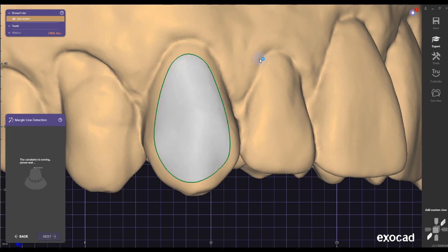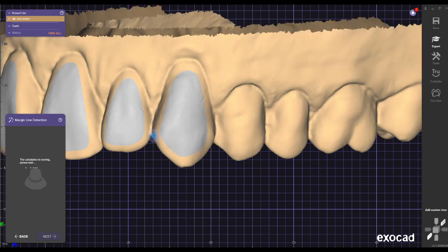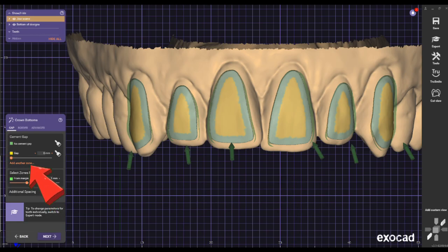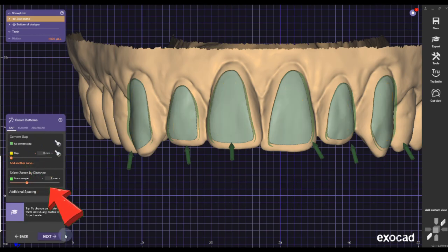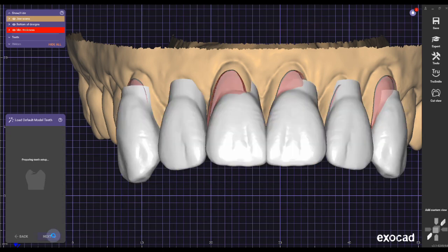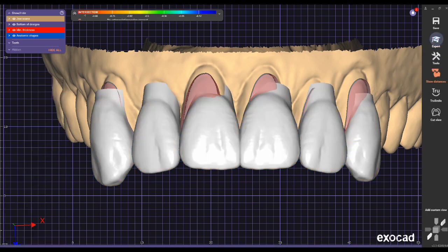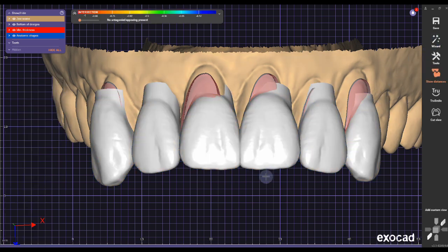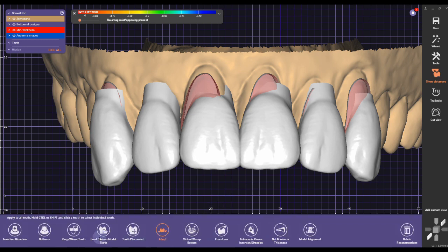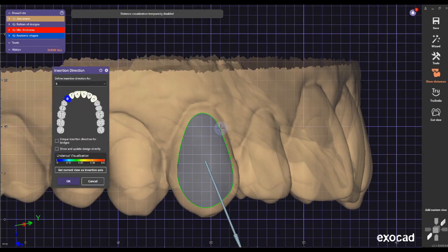When you're done with everything it should look like this, with all teeth completed. The important step here is to set the cement gap to zero — I don't want any extra cement gap. All I need is the surface and the window cutout.